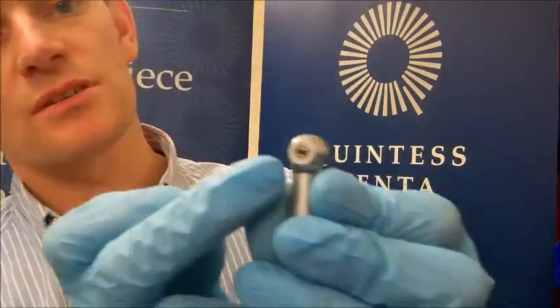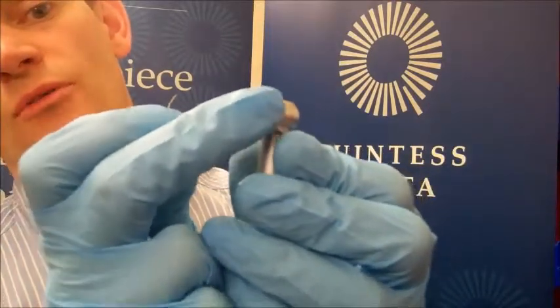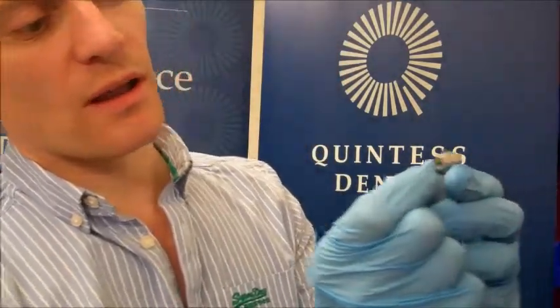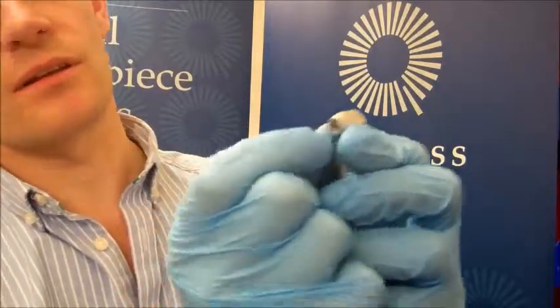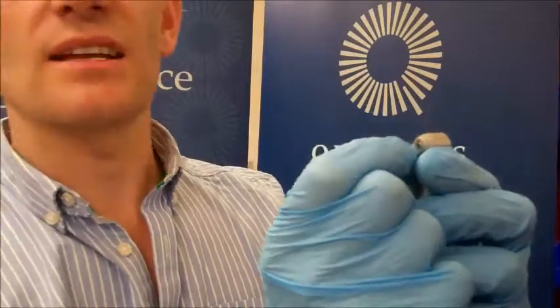If you have any problems with water blockages in the handpiece, take a little piece of fine wire, and you'll notice there's generally 1, 3, 4 or 5 holes around where the burr enters there. Those are your spray ports. Just go round one by one and insert the wire and give it a little wriggle about. So you're going around each one of those, and basically that's to try and open up that hole. If there is any debris in there, it's basically to push the dirt out of the way.